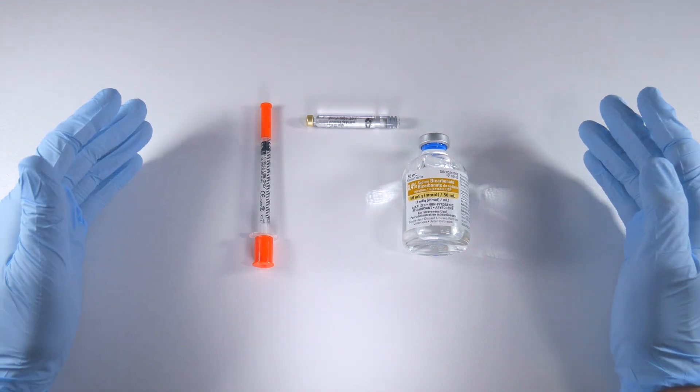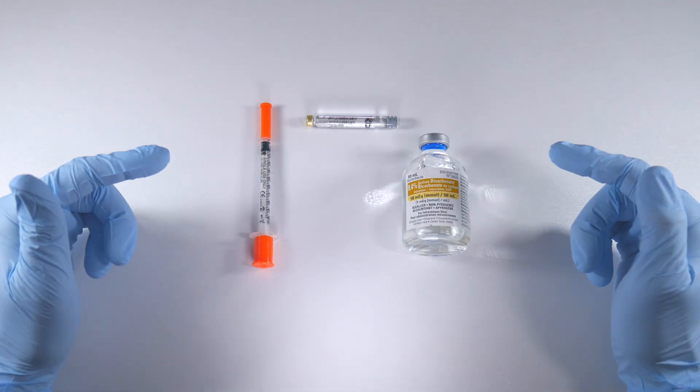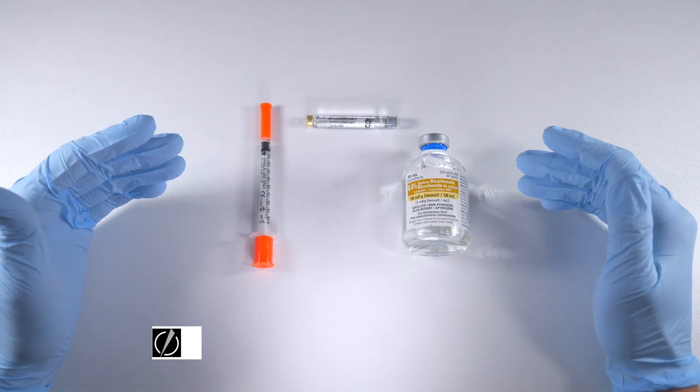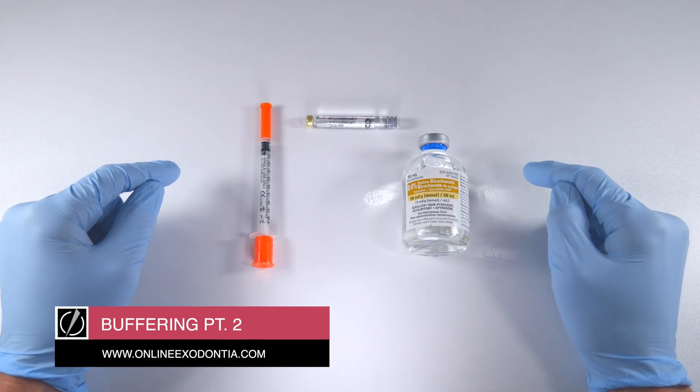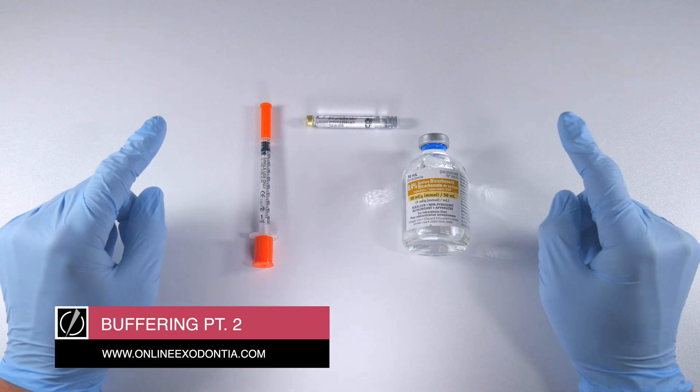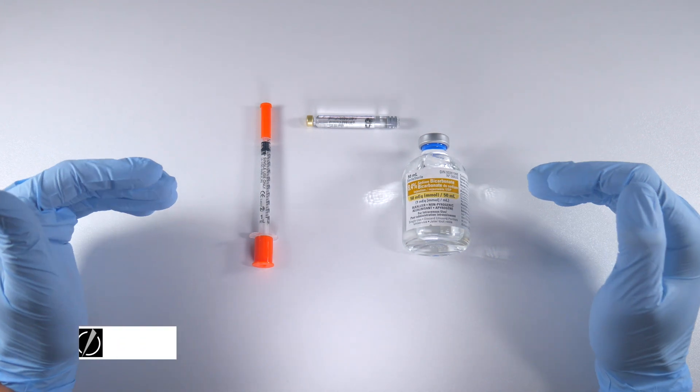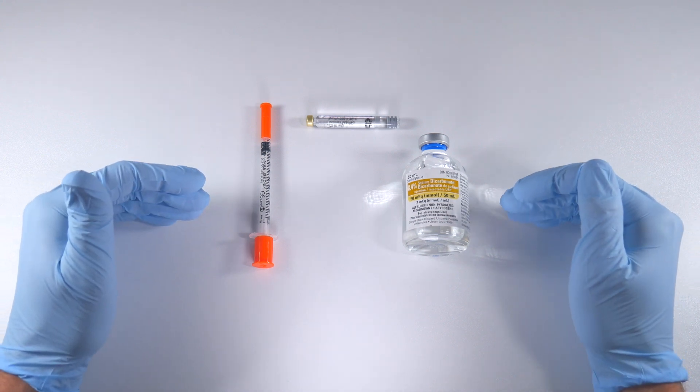So now that we've been through anesthetic buffering in our other video, I want to take you into a technique that I picked up online that I think you'll really like. This is something that you can use chairside for minimal cost, which I know dentists like, and you can do it very effectively and very efficiently right before you inject for your patients.